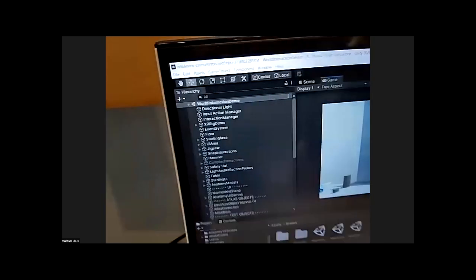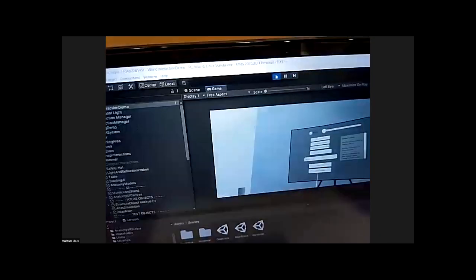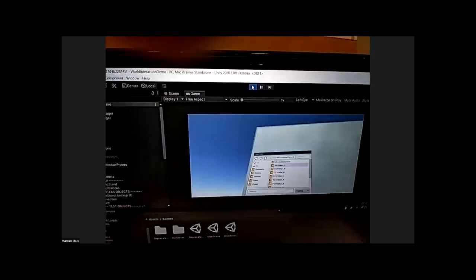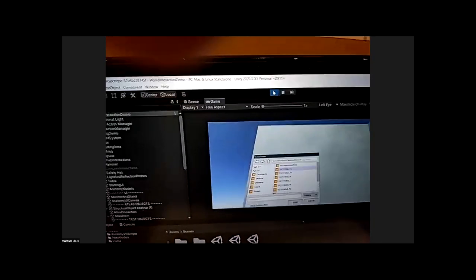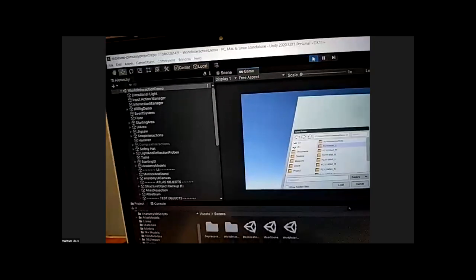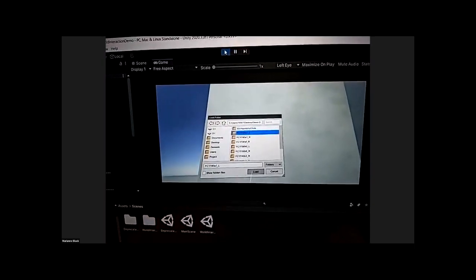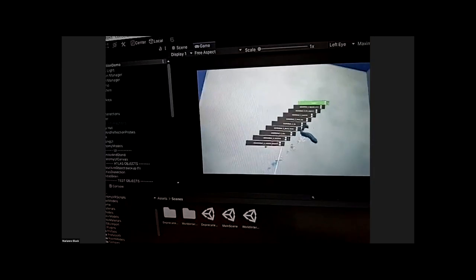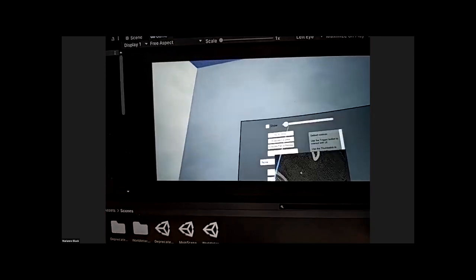All right. Okay, so we go to load folder. And then you can see here the files that you have. And then you can choose, for example, this one, and then load it. And then you will get the CT scan over here, along with all the segmentations that have been previously done using convolutional neural networks. Over here, you can, for example, go through the different scans.